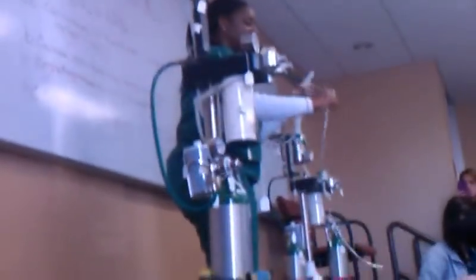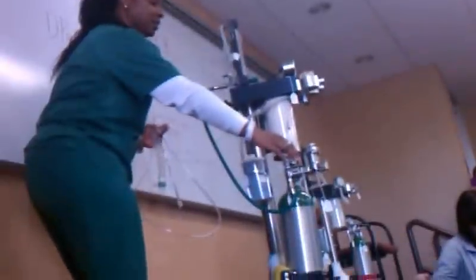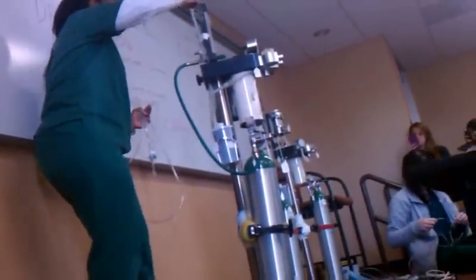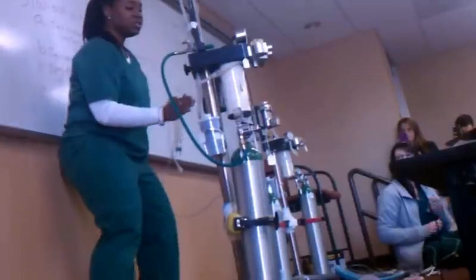Let's follow the flow of oxygen from the tank to our patient. We're going to start in the oxygen tank. Oxygen is going to leave the tank, go to the flow meter. When it leaves the flow meter, it's going to go to the vaporizer. When it leaves the vaporizer, it's going to go to the patient.